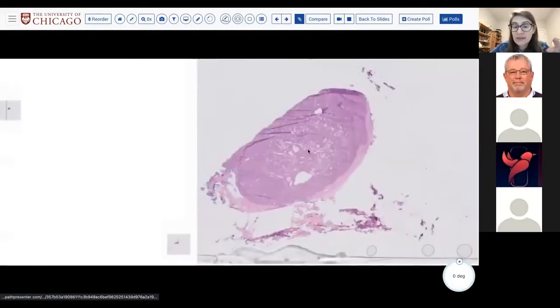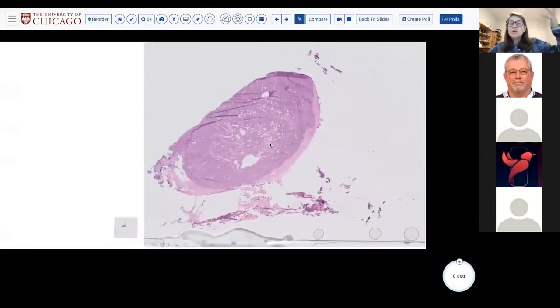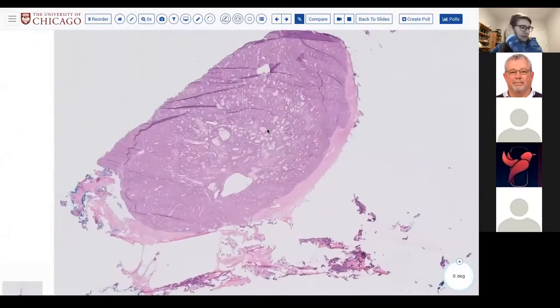So yeah, hopefully that was helpful. So you could call this a basal cell neoplasm, low grade, favor basal cell adenoma because of the beta-catenin, because as I said, beta-catenin really shouldn't be positive in the basal cell adenocarcinomas, but always caution on core biopsy.